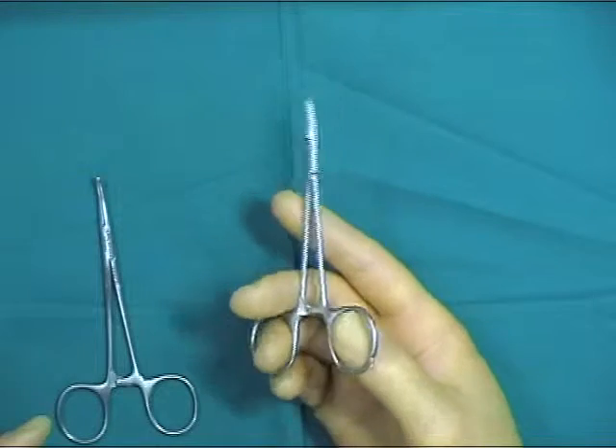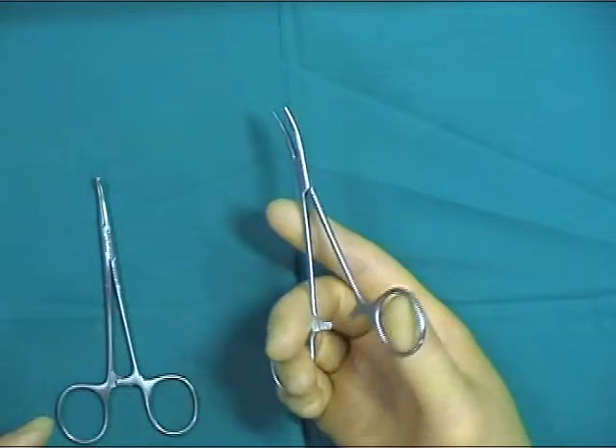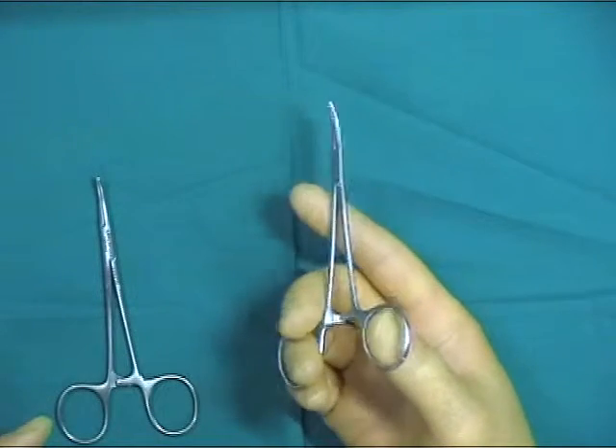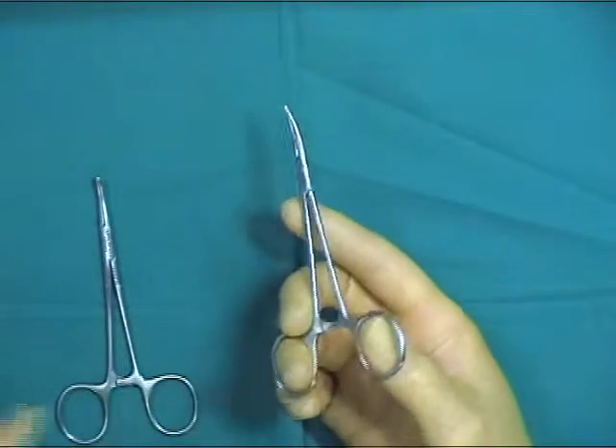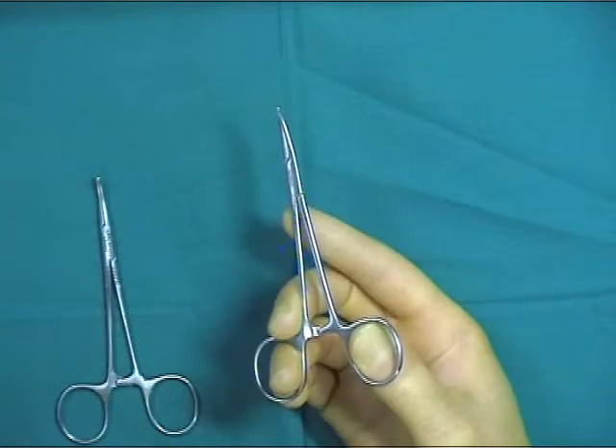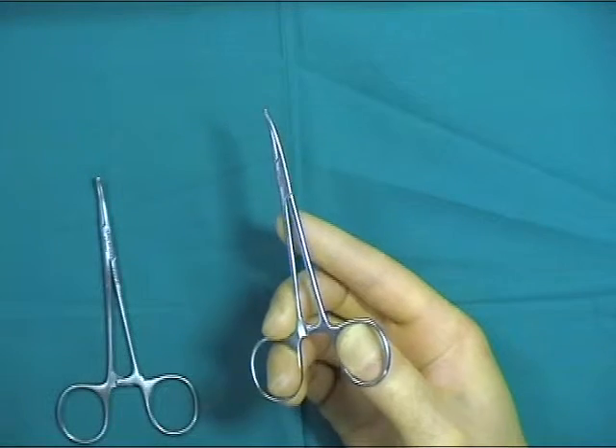Hemostats are held in a tripod fashion using the thumb and ring finger with the index finger extended down the shaft. The ratchet mechanism keeps the hemostat jaws tightly approximated and is unlocked by pushing the thumb in the direction shown.